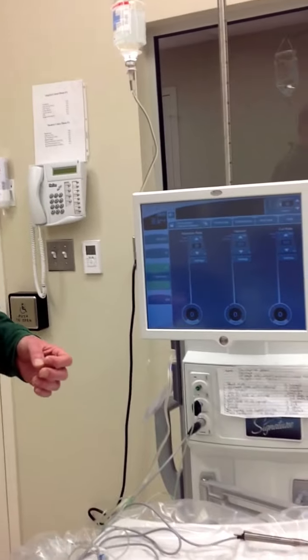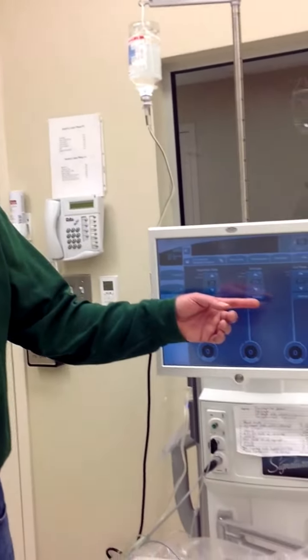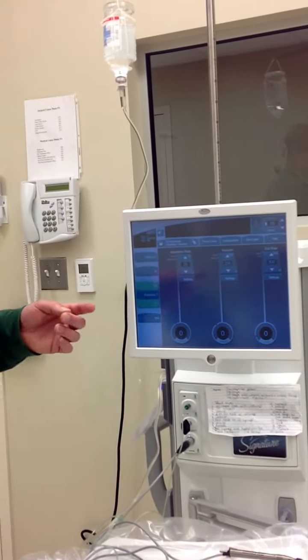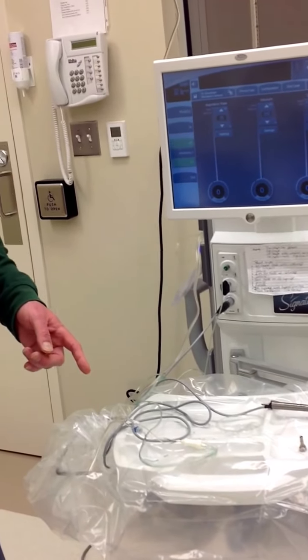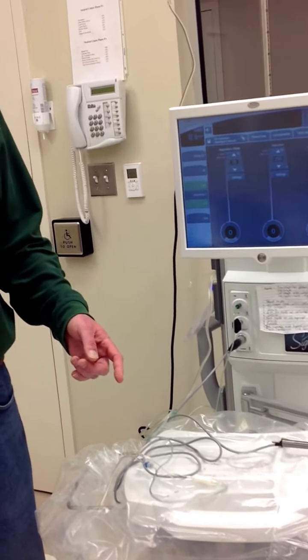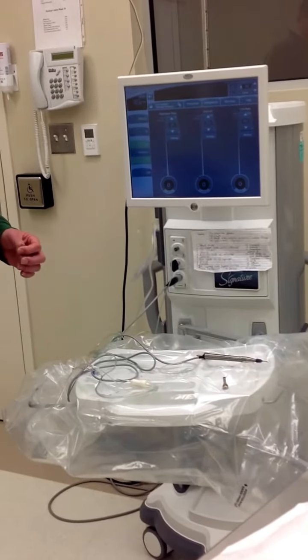At that 1,000 CPM cut rate, it wouldn't allow any material that wasn't virtually like a gel or a fluid to enter into the port. It's too fast. So you'd be spending a lot of time getting nothing done. Not to mention that when you're cleaning up around the capsule, the whole point of having the blade come on last is to allow you to use the vitrector as an IA handpiece in a way. And then naturally, if the doctor sees that he's engaged some vitreous, he floors it, and the blade turns on and cuts it. So that's how that works.